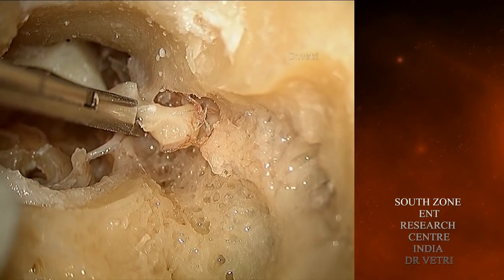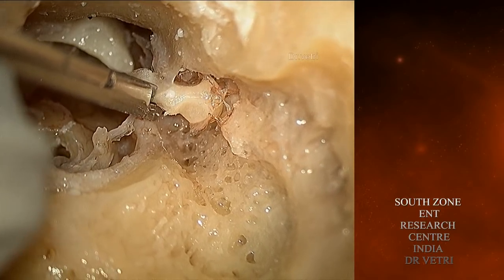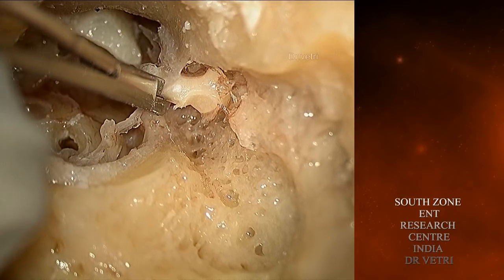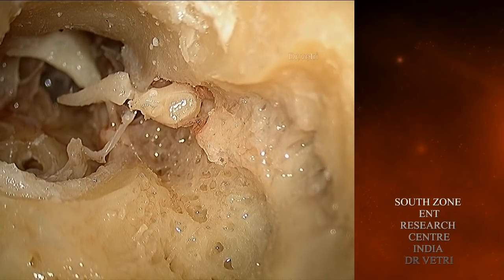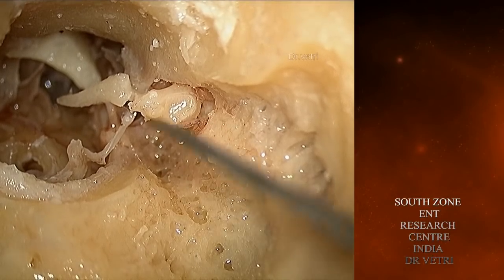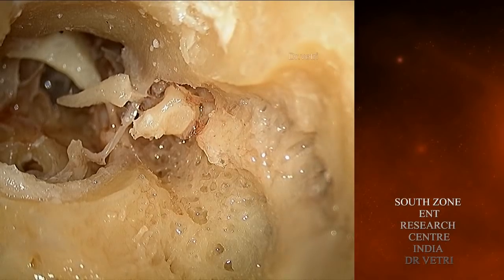I am using a malleus head clipper to clip the head of the malleus. The neck of the malleus is the narrowest part and the site to be clipped. Be careful not to injure the underlying chorda tympani while clipping the head of the malleus.